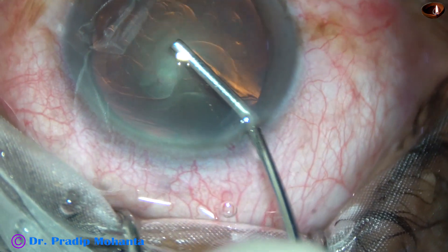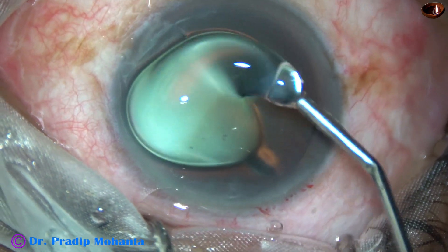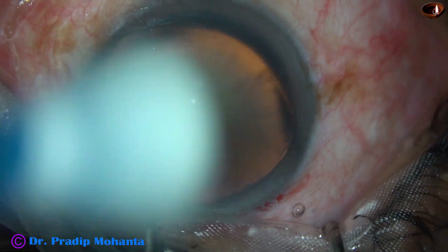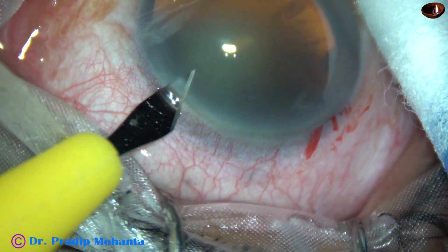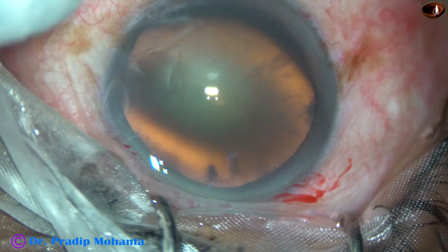After the main incision, the anterior chamber is filled up with 2% HPMC and the HPMC is applied over the cornea for better visibility. This is a side port on the right side of the main incision and this is another side port on the left side of the main incision. The side ports are about 3 o'clock away from the main incision.